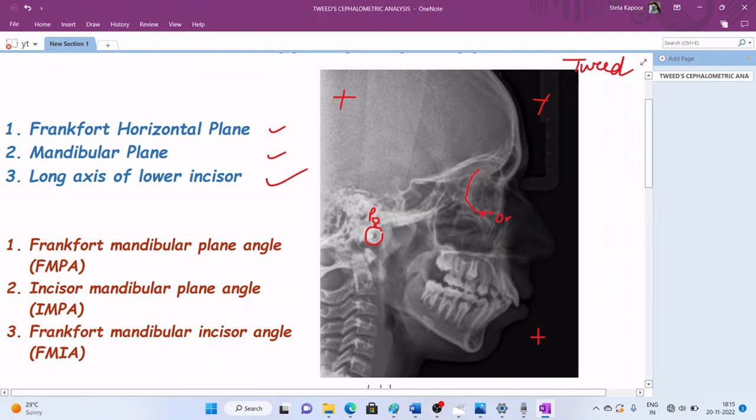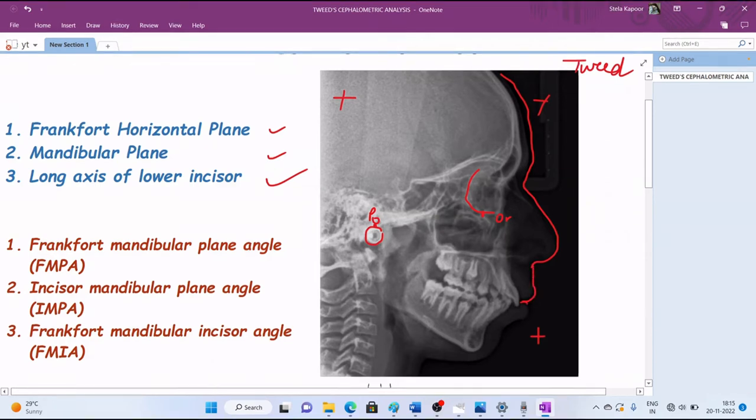When we start tracing, first we need to mark and trace the soft tissue of the face, and ideally you do it in a single go without lifting your pencil up. This is the soft tissue.